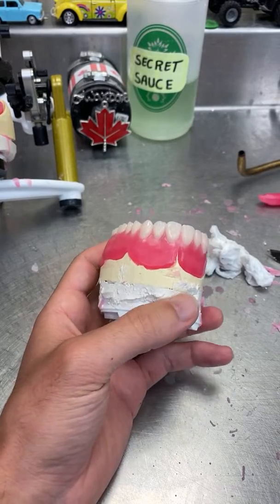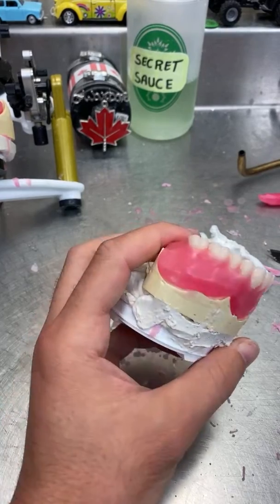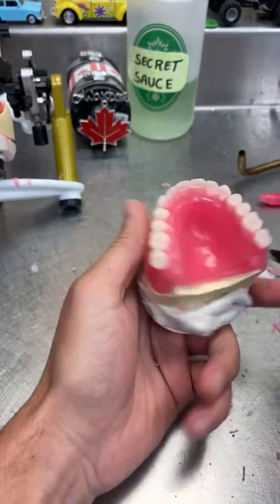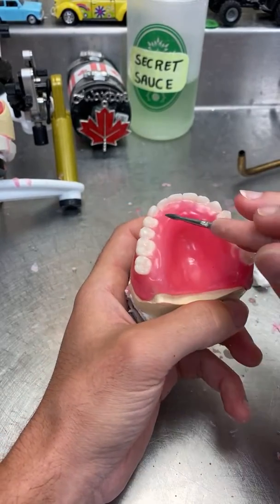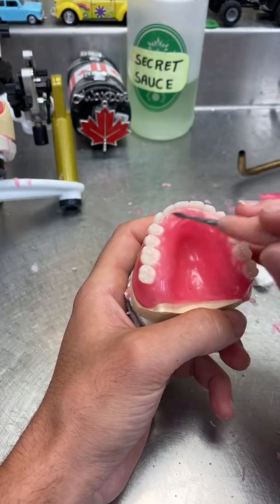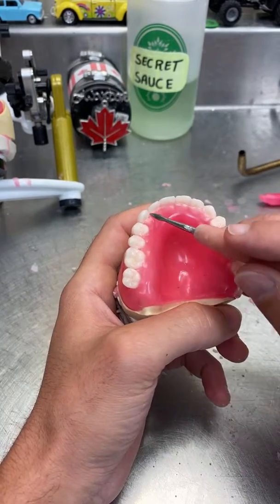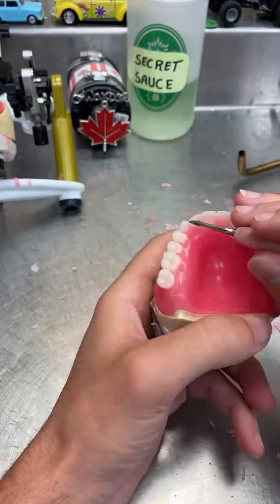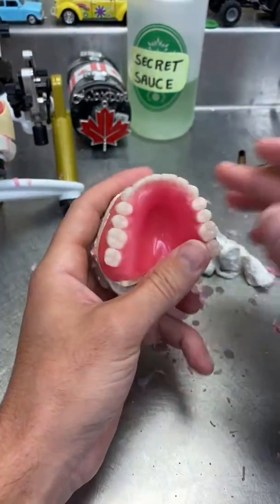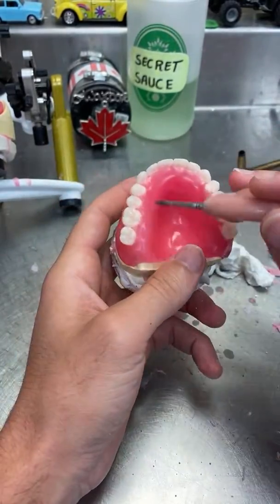Wow, it's almost synced. Okay, so I will not do this here because it's a try-in and I don't want to carve it, and then it will be too weak and maybe the patient will bite too hard and it will knock the teeth out. So I'll leave that, and also don't get any saliva in it or anything like that. Just leave that one here. But before finishing it, I must do it.